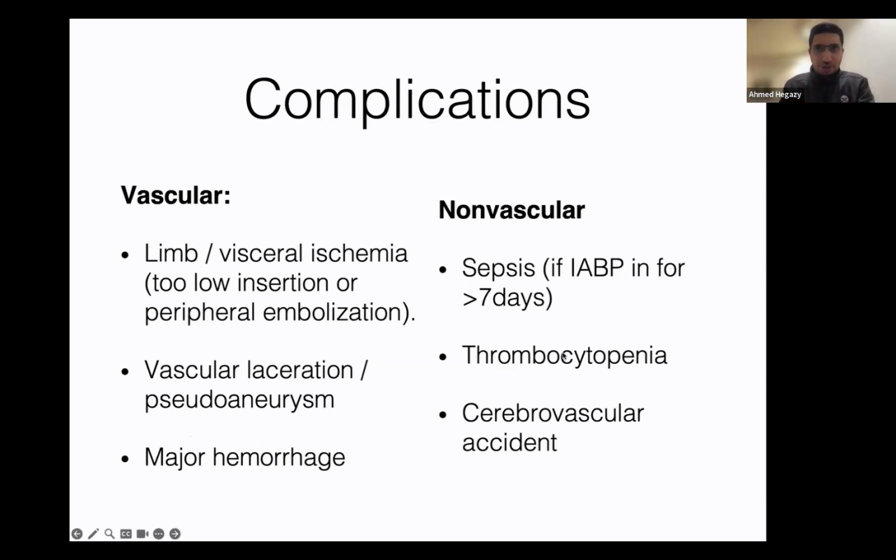Thrombocytopenia tends to be very common with balloon pumps. Most of our patients, over time, you'll start to see a drop in their platelet count because of consumption. So cerebrovascular accidents can happen, and the usual cause of CVAs is excessive flushing, or if your balloon pump is too high up and you keep flushing, and you embolize air into the carotids. There have been case reports of strokes with balloon pumps, likely related to the tip being too high in location and encroaching on the carotid arteries.